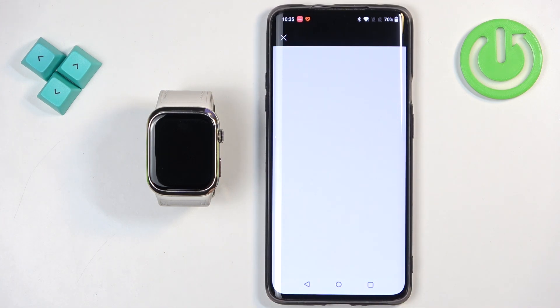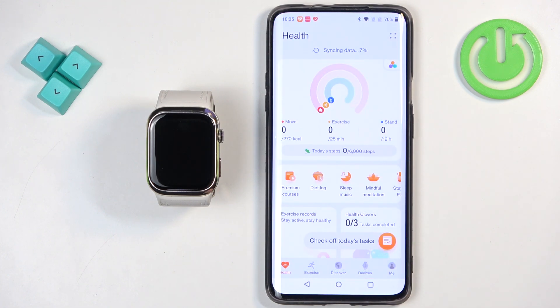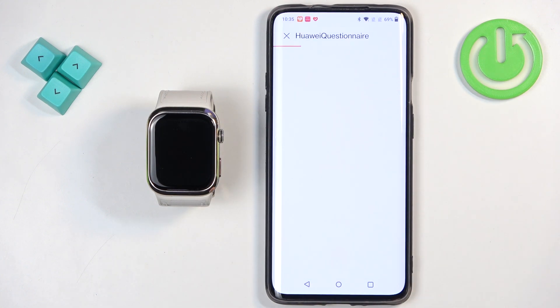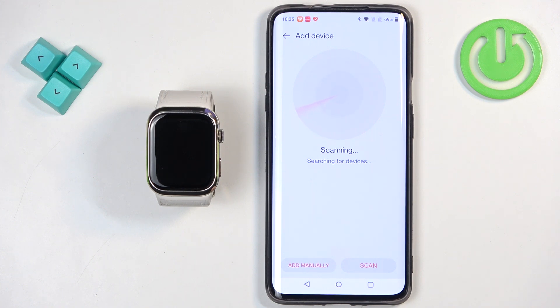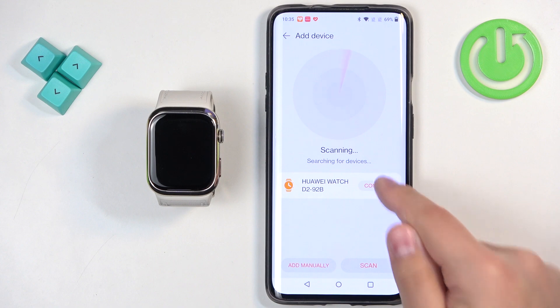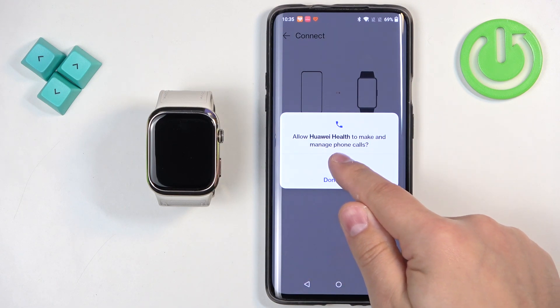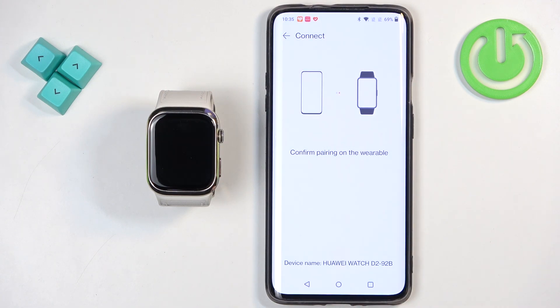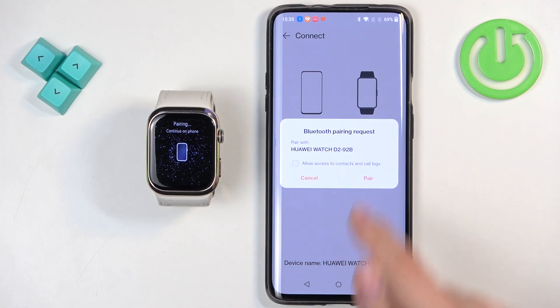After you log in, you will probably need to tap on devices again because the app will restart. Tap on devices, then tap on add device — it will start scanning again. Tap on connect next to your Huawei Watch D2. Allow the required permission for phone calls. On the watch, confirm by tapping on the check mark, and on the phone, tap on pair.